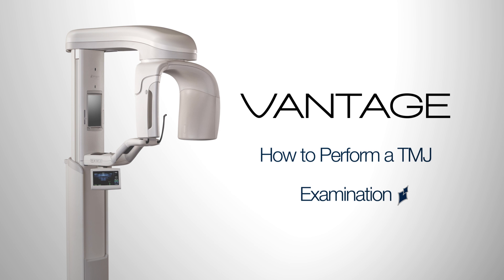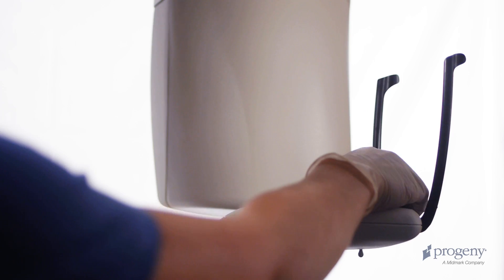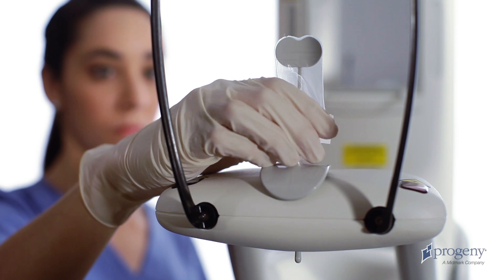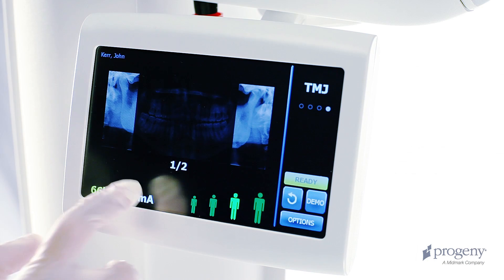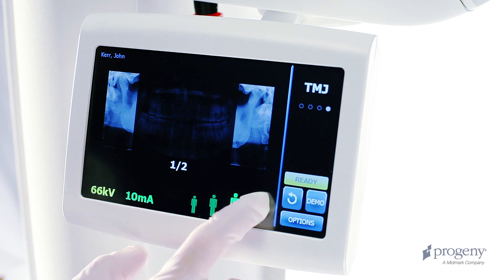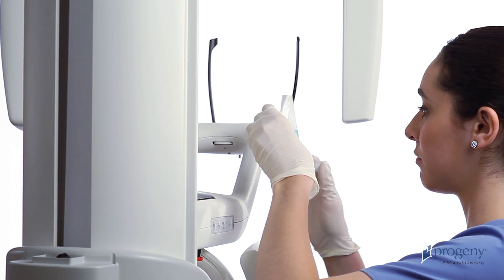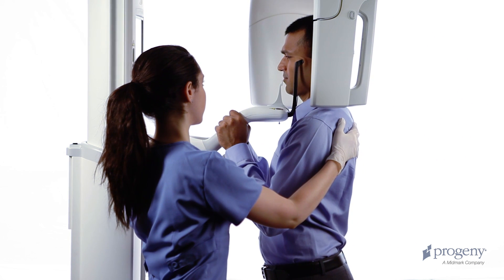How to perform the TMJ examination. To perform a TMJ examination, first exchange the panoramic bite piece and chin rest for the TMJ positioner. Choose the TMJ exam on the control panel. Verify the technique according to patient size and anatomy. Explain the examination process to the patient. Ask the patient to remove glasses and jewelry. Place the sanitary barrier on the positioner. Inform the patient to stand at full height and draw the patient into the structure.